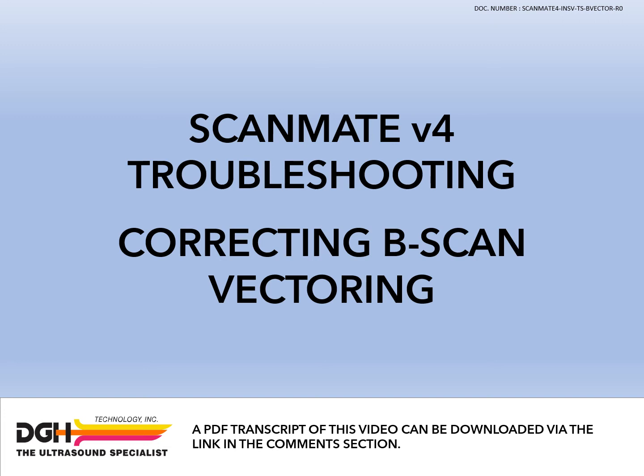This instructional video explains how to adjust system settings to correct bscan vectoring issues in the Scanmate version 4 software.